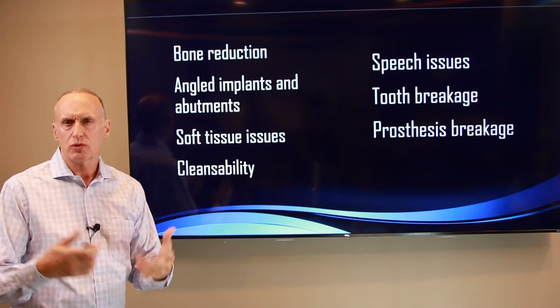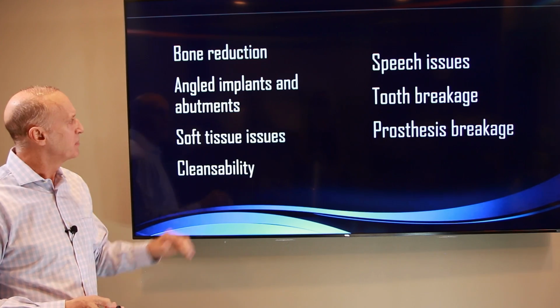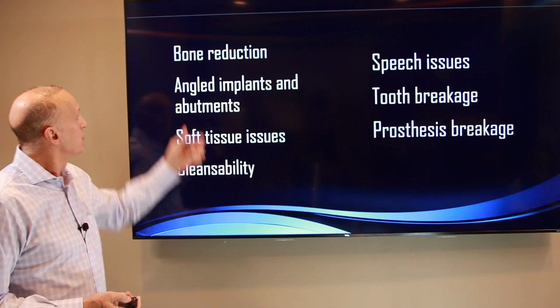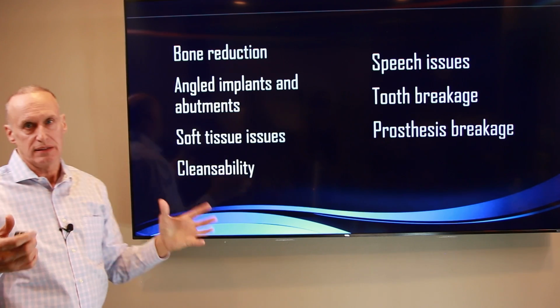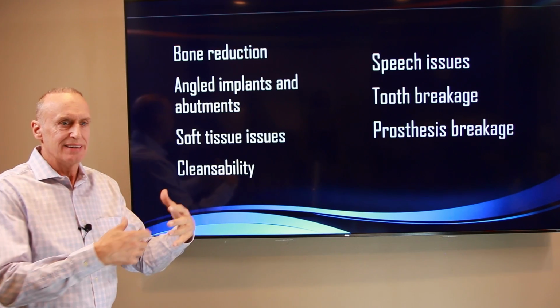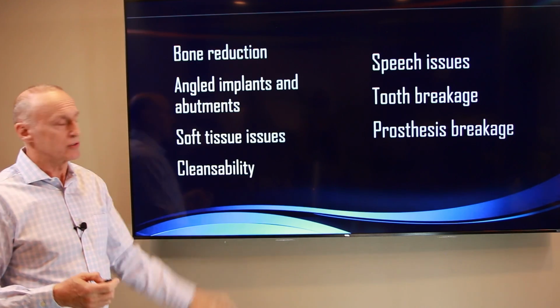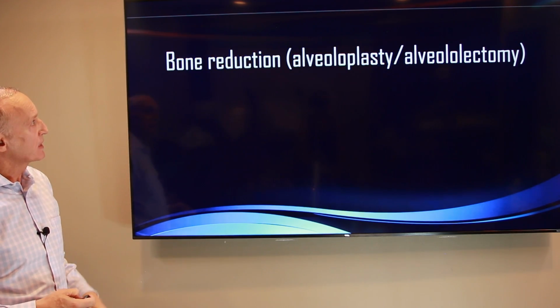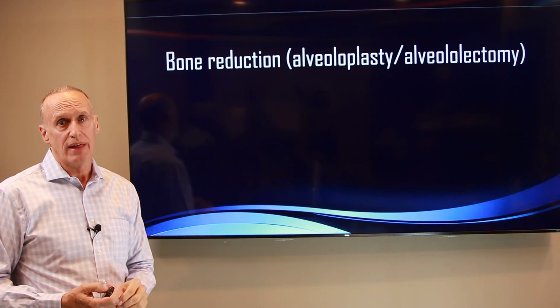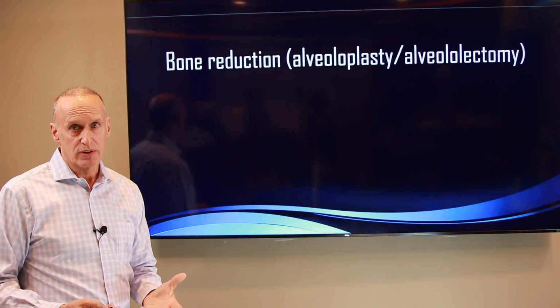In my other videos, and we'll show you links to those below near the comments, these are the 7 things that I don't like about the All-On-4 protocol. But these first 2 are the ones that are really driving the negative impact of All-On-4. These are the 2 that drive all of the other factors, really. So we'll talk about bone reduction, and I already said alveoplasty versus alveolectomy. If you haven't watched my video on that, please do. It's powerful. Educate yourself on what you're signing up for.